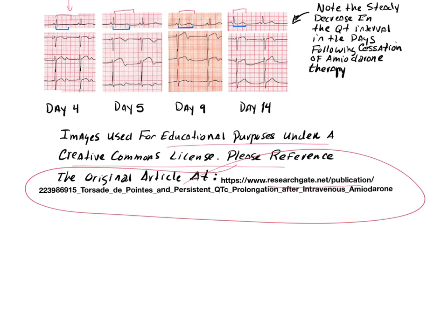So at the end of the day, QT interval too long and too short can put us at high risk for ventricular dysrhythmias, specifically torsades. When it's too long, what are our thresholds? Over 500 in both men and women, and under 350, right? You guys okay with that?